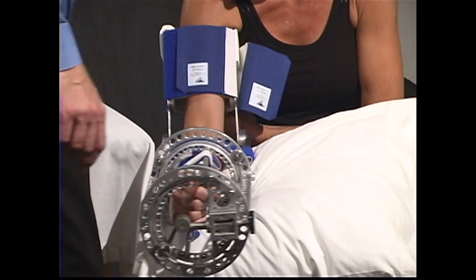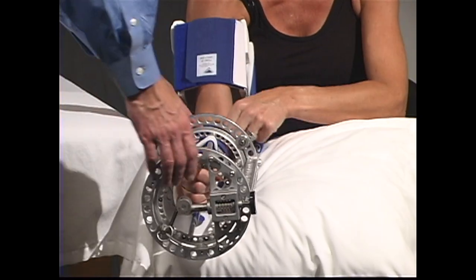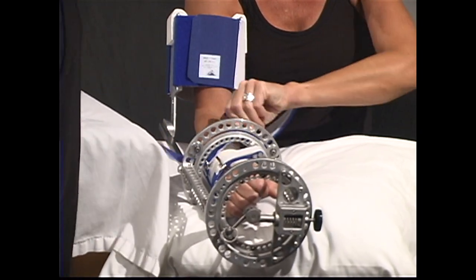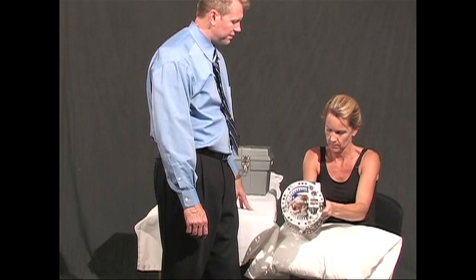Loosen or remove the back of upper arm cuff, then loosen the 2-inch strap on your forearm. And finally, loosen all of the other hook and loop straps on the wrist stabilizer. Slide your arm out of the back of the unit.